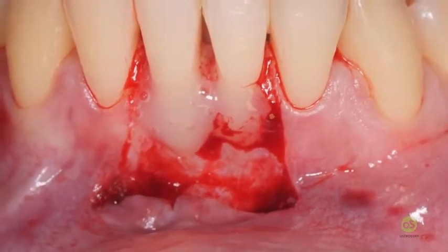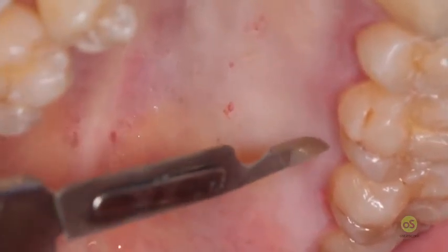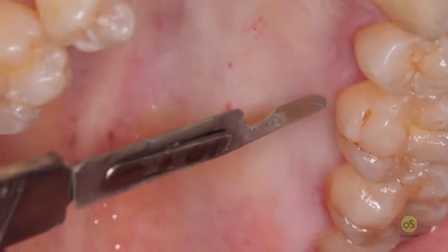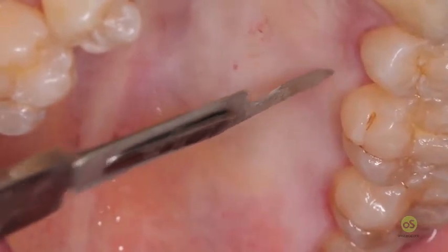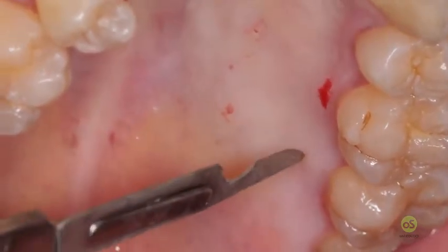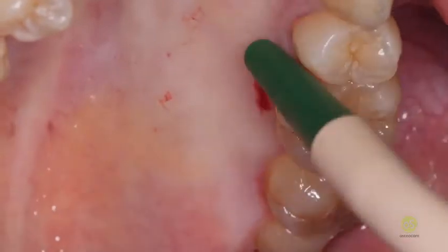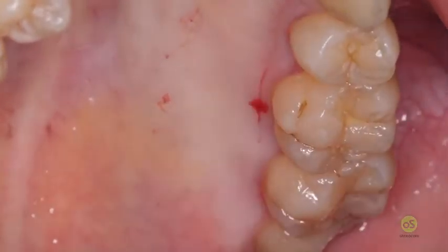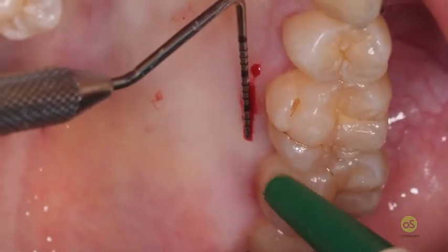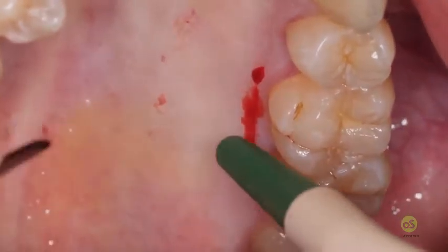Okay, now it's time to go to the palate. Okay, the incision as close as I can to the teeth. Always avoid the area of the rugae. I check the dimension. 13, right? Yes. So it should be longer than this.